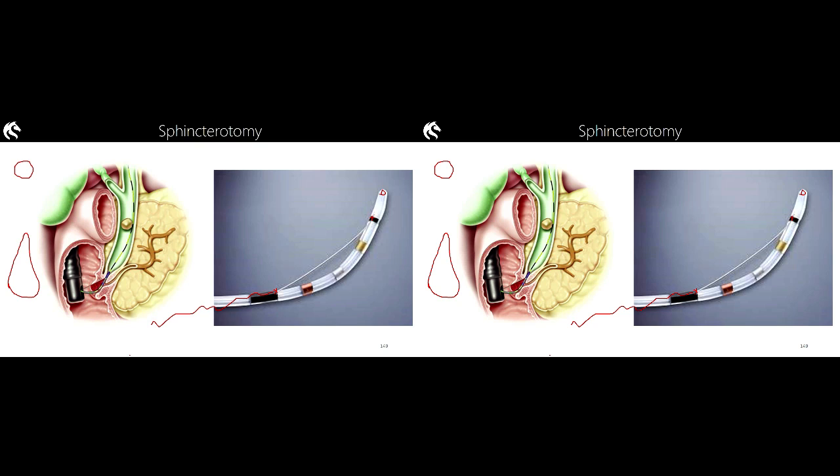Now, if the gastroenterologist were to hold the catheter and pull on the wire, it's going to go from being a straight structure to being a curved structure, okay? You can see that this wire is fairly straight and the catheter is curved. The more we were to pull on the wire, well, that catheter might end up being quite a long curve indeed, okay?